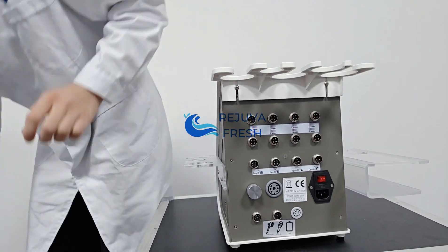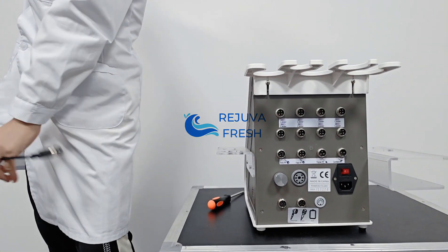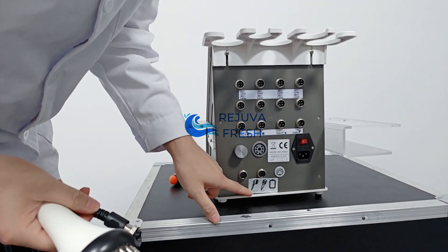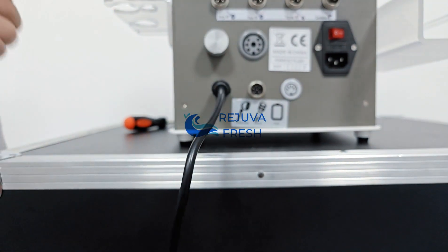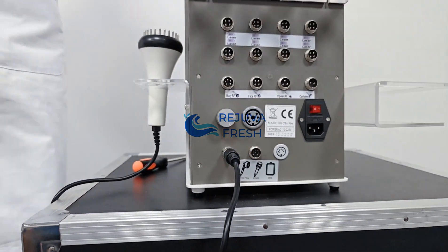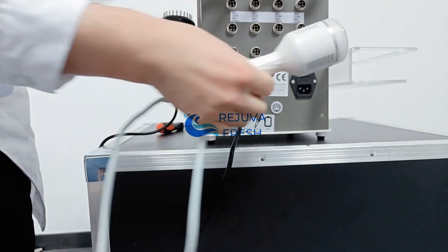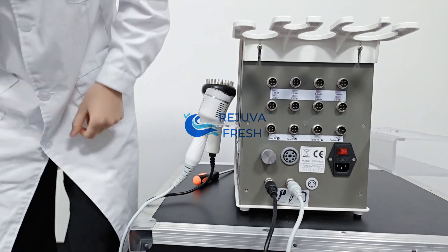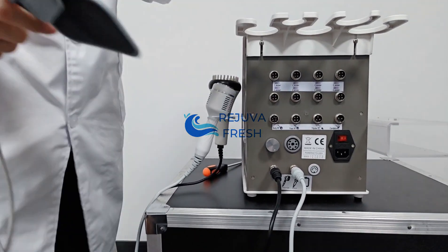Next, we are going to connect the handles with the machine. This is the photon handle — you can see the photon port here. Next is the cold handle — you can see the port here. Then connect the EMS pad.